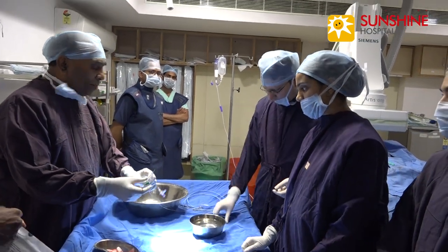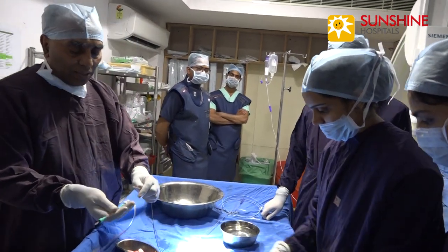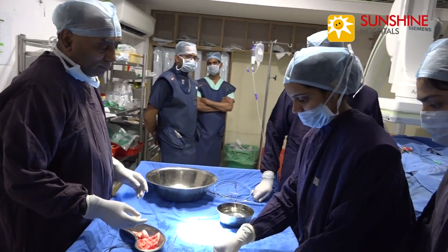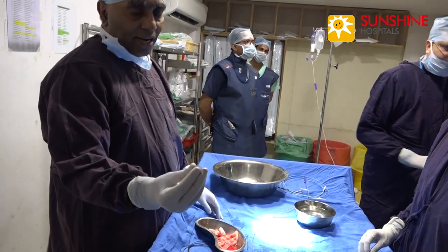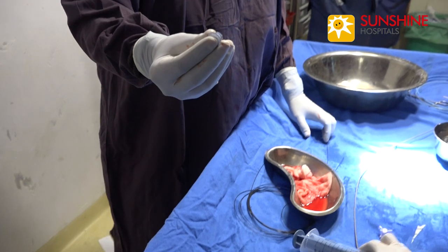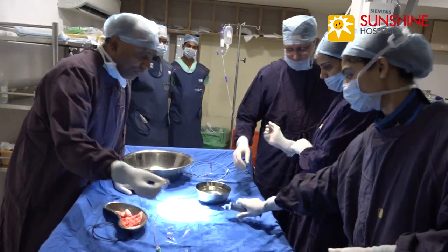Now we are showing how the PDA device is loaded. The PDA device is called the Amplatzer device. It is made of nitinol alloy. It has two ends, the aortic end and the pulmonary end. The aortic end is usually larger when compared to the pulmonary end. It should be immersed in heparinized saline.